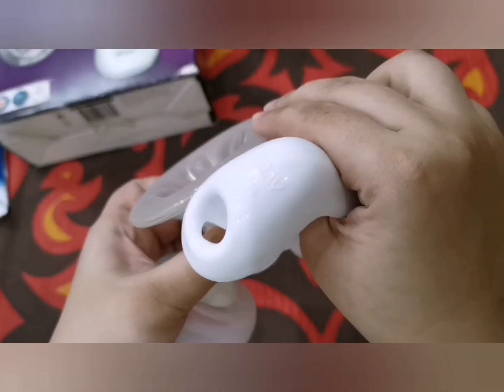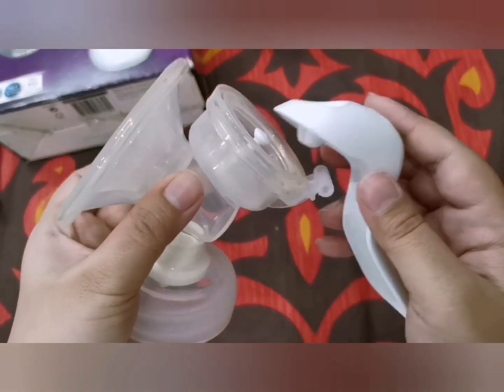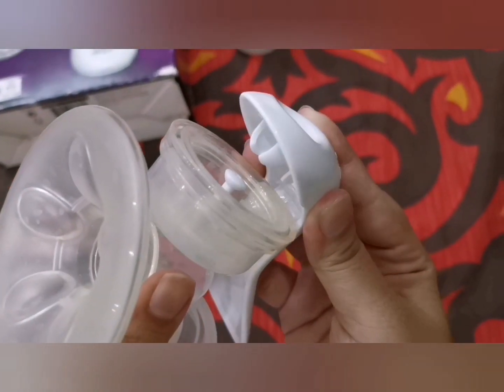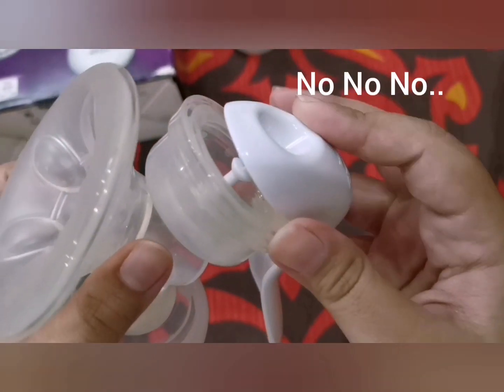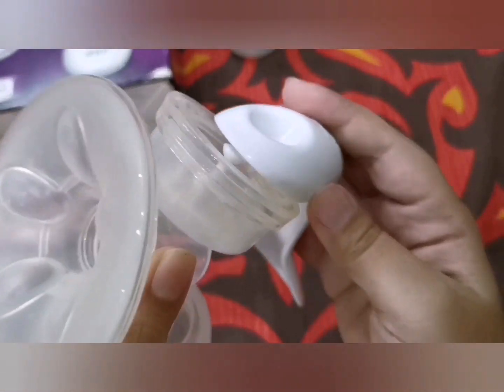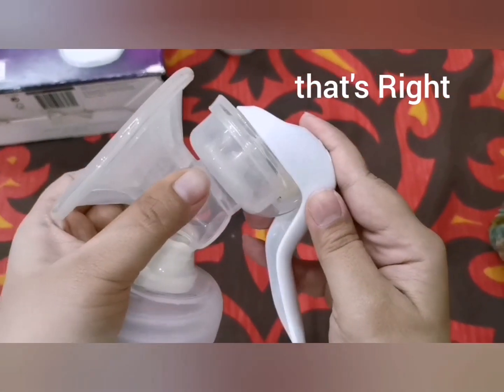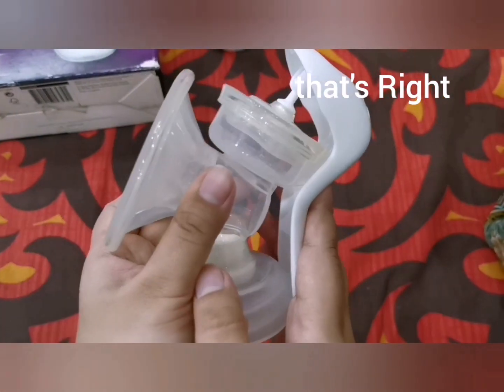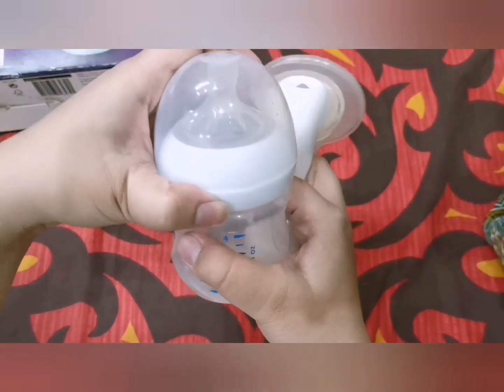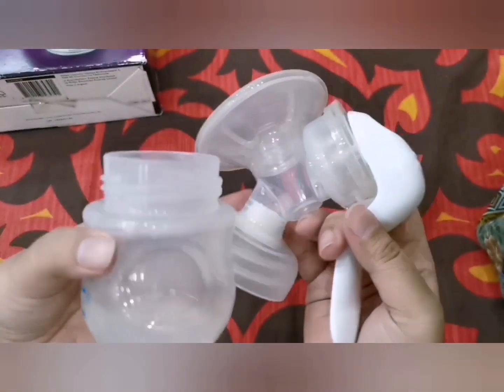This is the last part — the handle. What I do is fix this part first, then take the handle and attach it here like this — and there you go. Now attach the four-ounce feeding bottle to complete the assembly.